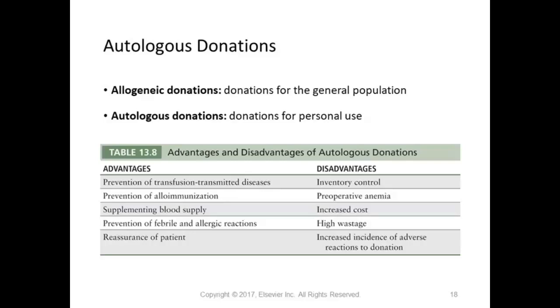Now, with the procedure on an autologous unit to cross-match that, the doctor is still going to order cross-match times 2 units, and they may put in comments, patient has autologous unit. So again, the autologous unit is retyped just like any other unit would be, but some facilities also perform a cross-match.